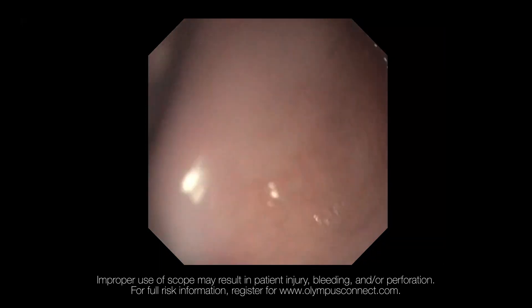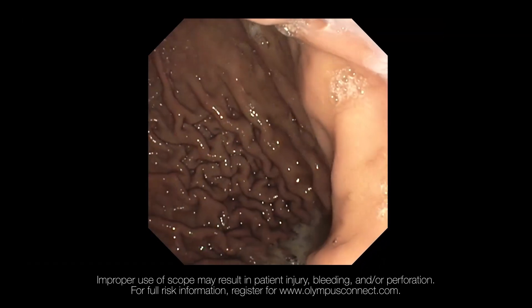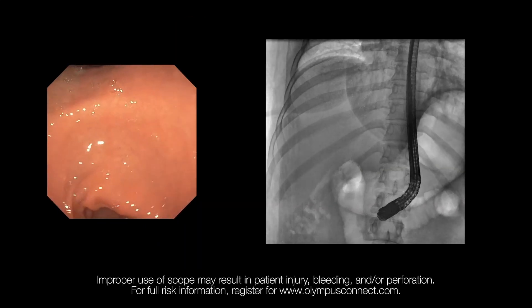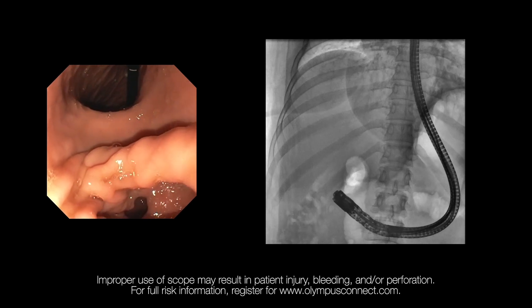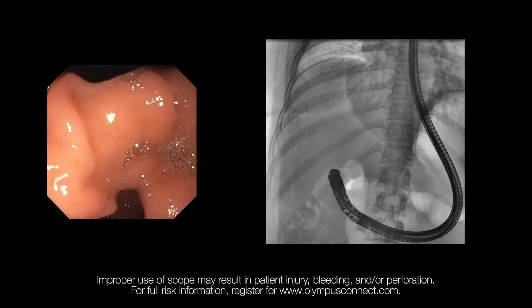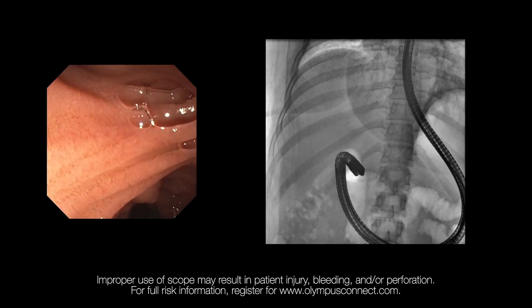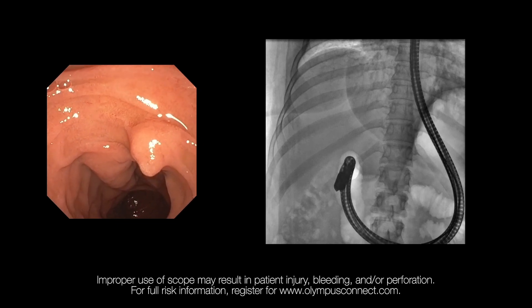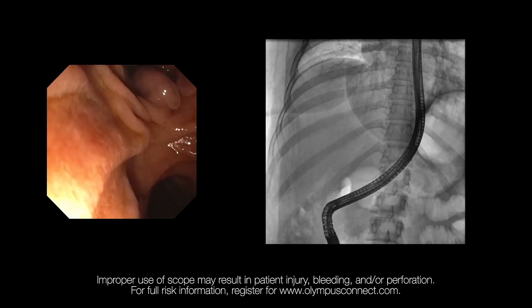In this video, I show my experience of performing ERCP with the TJF 190 duodenal scope. I advance the scope gently through the esophagus. Once I reach the stomach, I insufflate the stomach and follow the gastric folds towards the antrum of the stomach. Once I reach the pylorus, I use the pylorus in sunset view to enter into the duodenal bulb. From the duodenal bulb, I follow the lumen to reach the second part of the duodenum. Once in the second part, the scope is rotated clockwise and retracted to get into short scope position and to study the papilla.